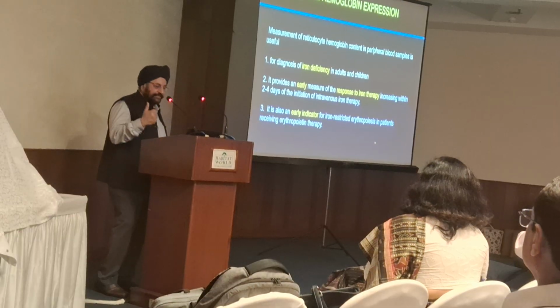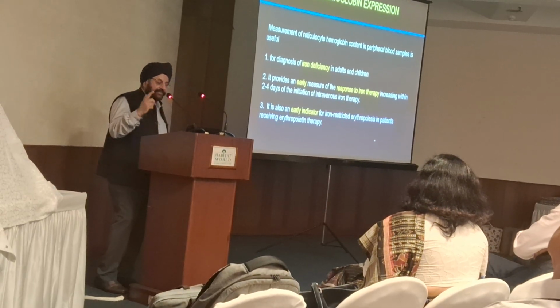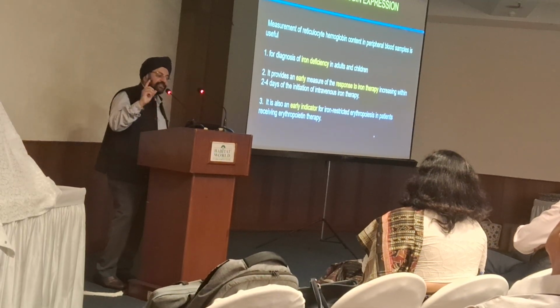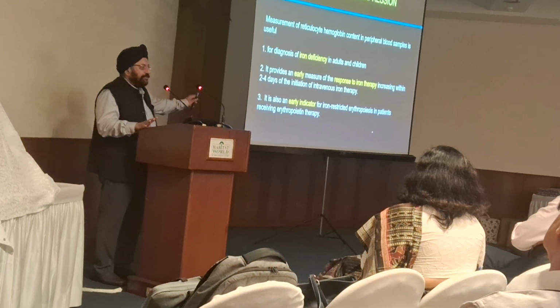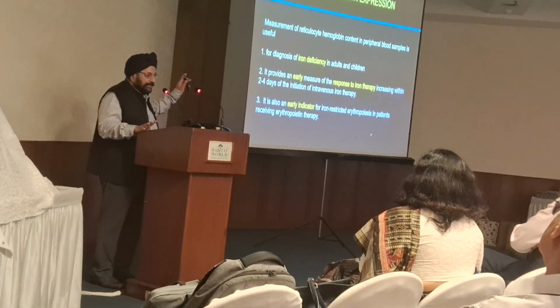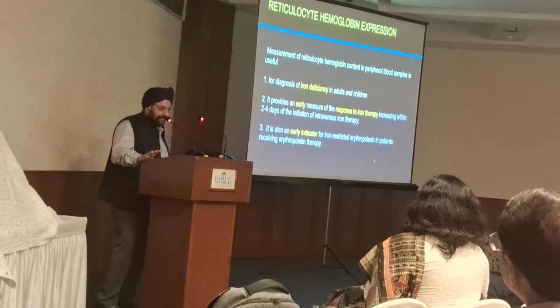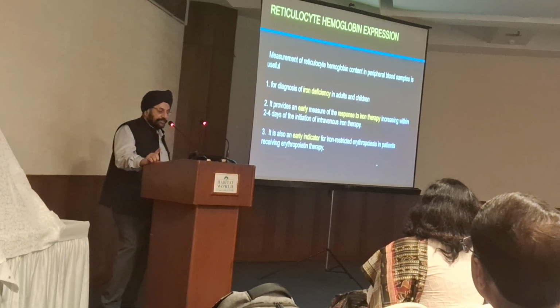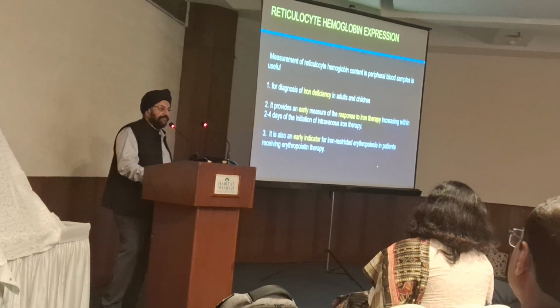So what it does is, it diagnoses iron deficiency. It is the earliest measure of response to iron therapy, much before hemoglobin, much before ferritin. After administering IV iron to a patient, this parameter increases within 72 hours, so you know that you are on the right track. It is also an early indicator of iron-restricted erythropoiesis in patients receiving erythropoietin therapy, particularly CRF patients.